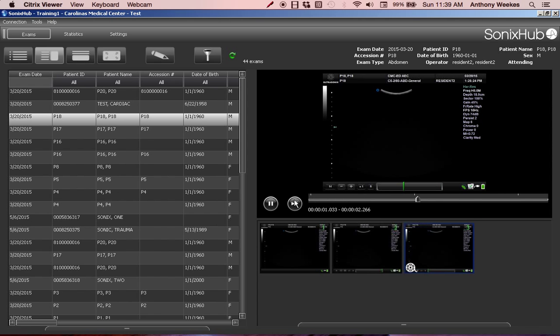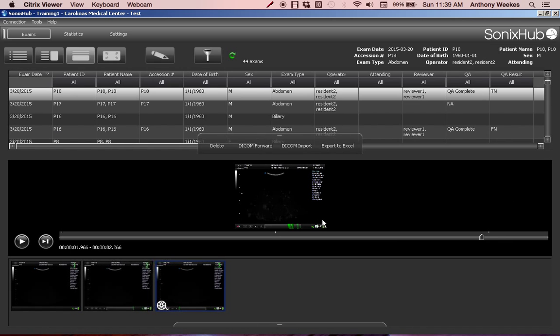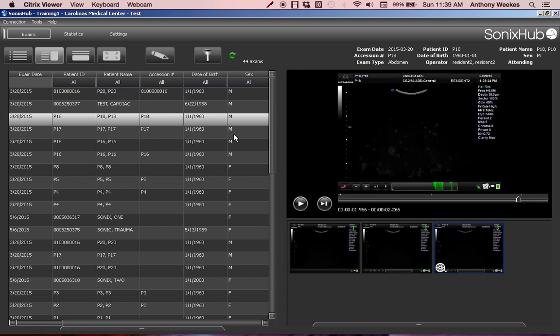And here's a cool thing, you can stop the video, move it forward just a little bit so you can see that right ventricular free wall collapse, or see what's happening if there's a little vegetation on the tricuspid valve. And you can take those images if you need and slowly move back and forth to see if diastolic wall collapse is occurring slowly by slowly. Okay. The other option is you can change the layout where it's on top of the other. So let's go back to this one, which I prefer.